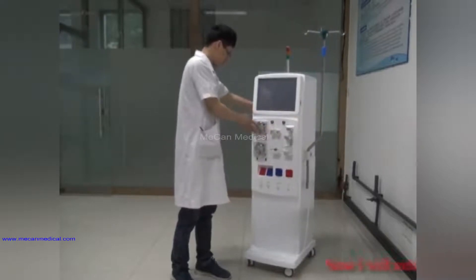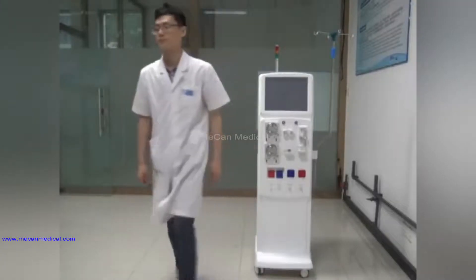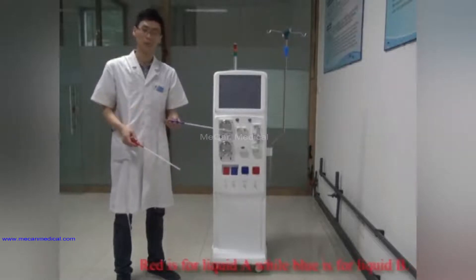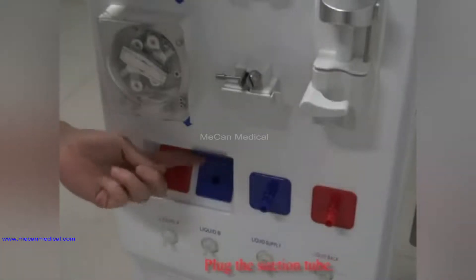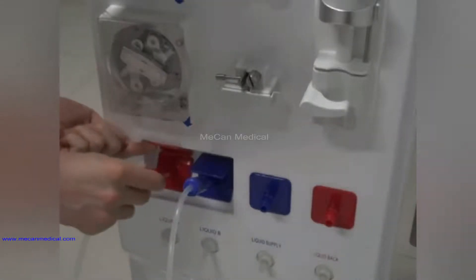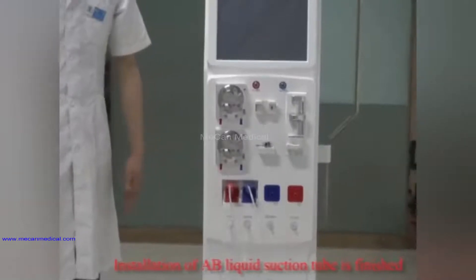Now I will introduce you the tube connection. Here are the AB liquid suction tubes. Red is for liquid A while blue is for liquid B. Plug the suction tube. Installation of the liquid suction tube is finished.